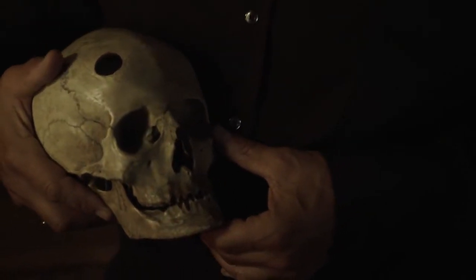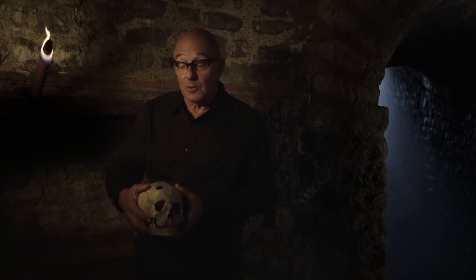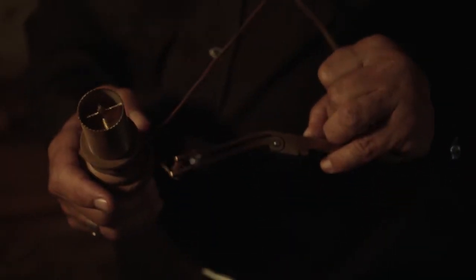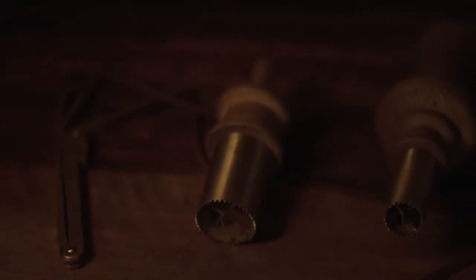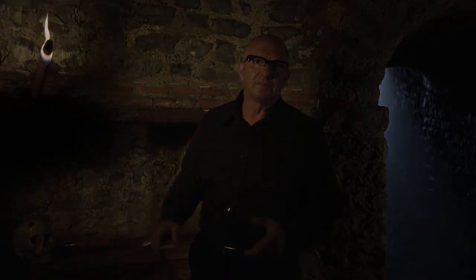For instance, judging by the smooth edges in this craniotomy, it can be concluded that this patient survived such a traumatic intervention. Early surgeons achieved incredible results using tools to make round holes or a saw of this type to cut straight lines. These mechanical tools have evolved over time, but have retained the archaic principle.